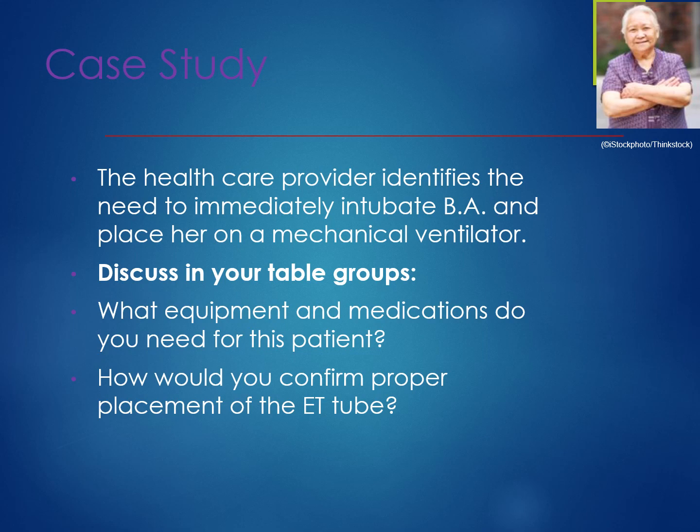We're also going to need an end-tidal CO2 detector, and this detector basically changes color, depending on the manufacturer, for what color it changes, and it notes the presence of exhaled CO2. So this is hooked up to the end of the ET tube, again, to make sure that once they're intubated, we're in the lungs.